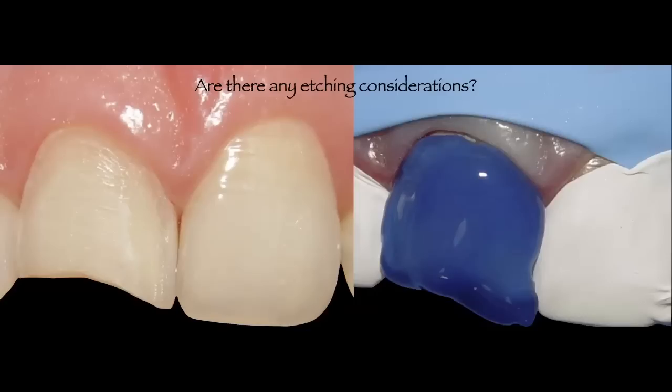And the reason for that is because you most likely are going to have a layer of fluoroapatite on that enamel. And that fluoroapatite layer of enamel is more acid resistant. So when you prep, you remove that acid resistant layer of enamel, so you can etch for less time and you will achieve a really good etched surface. But when you don't remove that fluoroapatite layer of enamel, I would highly recommend, and there's much research done in that area, increasing or doubling the time of etching with something that's been called dynamic etching, which is moving that acid, just making sure that you're creating a little bit of movement, or just pushing the acid around the tooth with a micro brush. That dynamic etching for 30 seconds will definitely help you achieve a better bond surface.